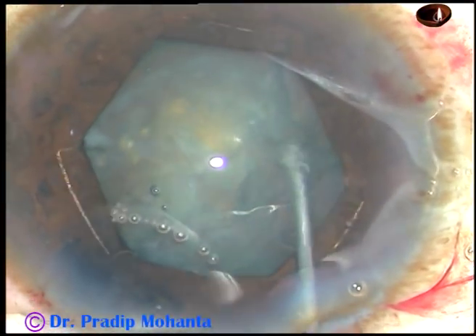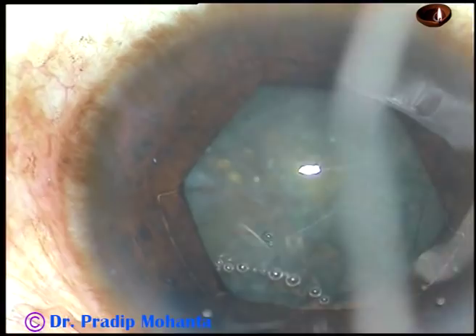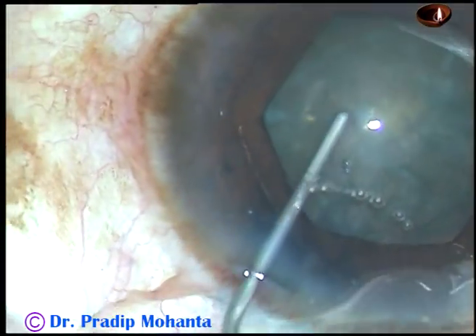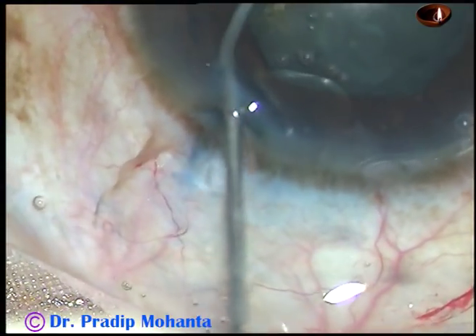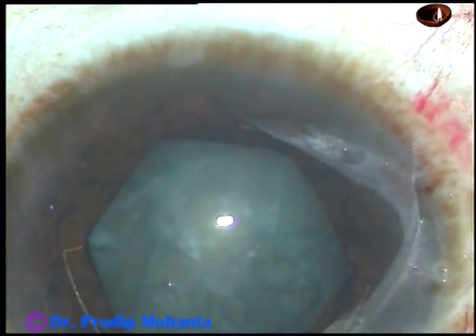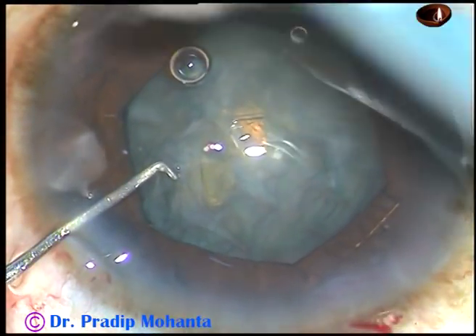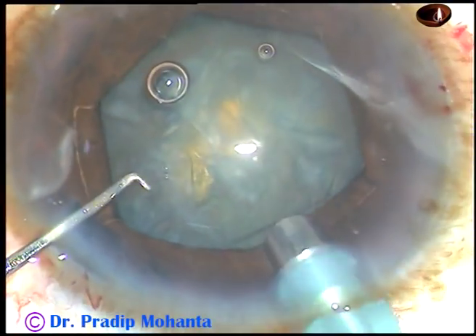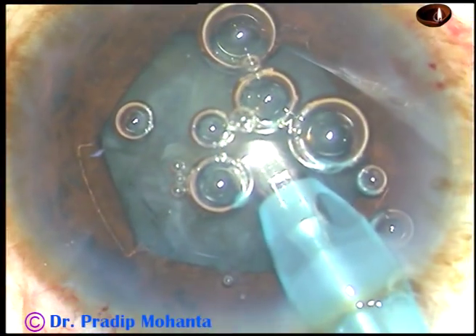In this case, I could not see any fluid wave. What has happened is probably some air bubble has gone behind. I am trying to pass some fluid underneath the anterior capsular rim at 6 o'clock and trying to mobilize the nucleus. But the capsulocortical adhesion was a bit sticky. Since I can do phaco even without hydrodissection, I didn't bother much.